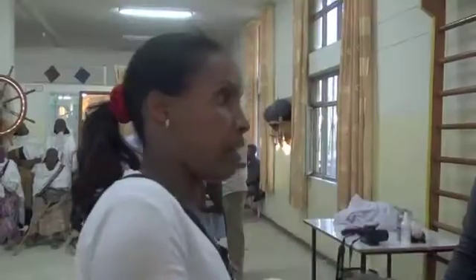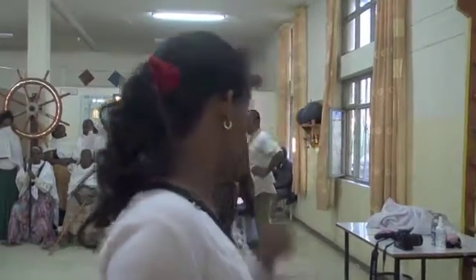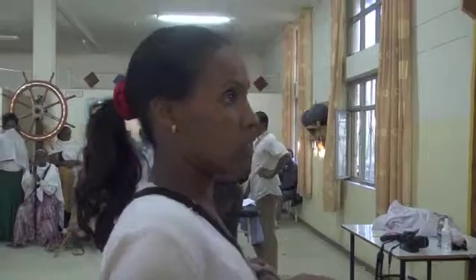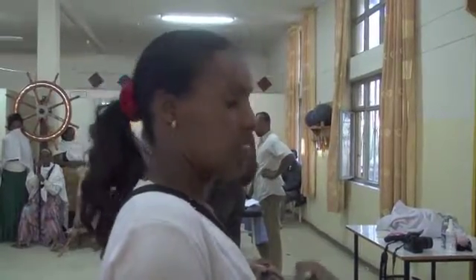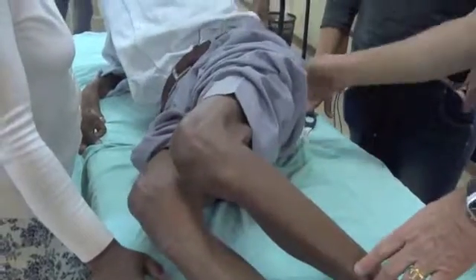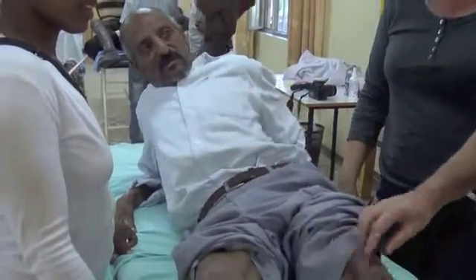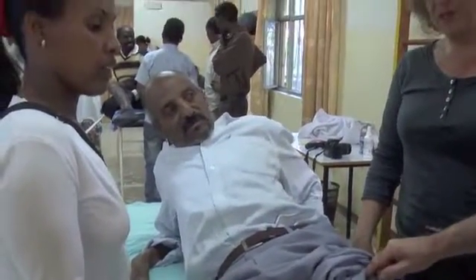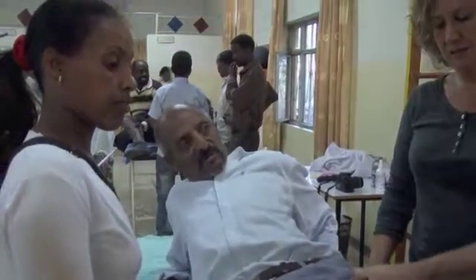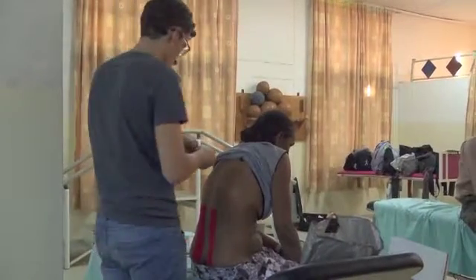Patient has pain everywhere, in the joint also, not in the knee but in the muscle. Lumbar application, two lumbar strips, then we have to do piriformis, and then I think we should start with quadriceps single strips.